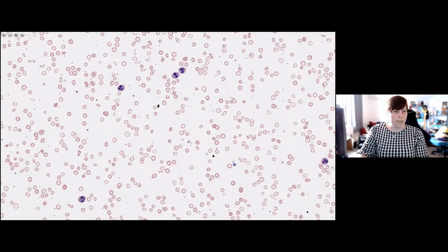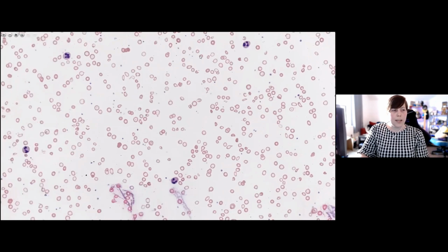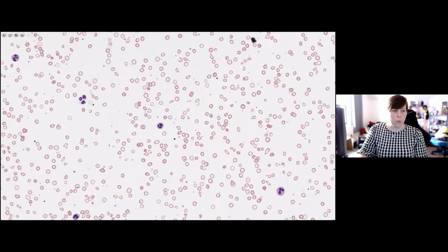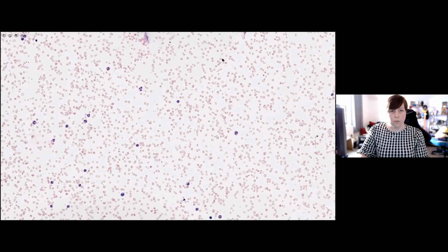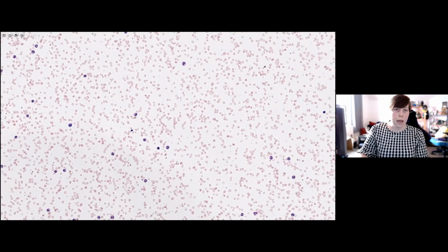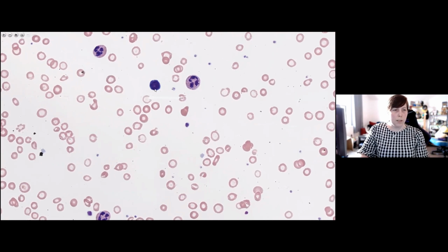What I want to do here is actually look around for a small lymphocyte. In our last webinar with Dan Pelling, he went over one of the ways that we review size of red cells, and that is by using the size of a small lymphocyte to compare. And by a small lymphocyte, I mean a nice normal small one like this one here, where it has a very deep condensed nucleus and not a whole lot of cytoplasm. This is a nice mature small lymphocyte.